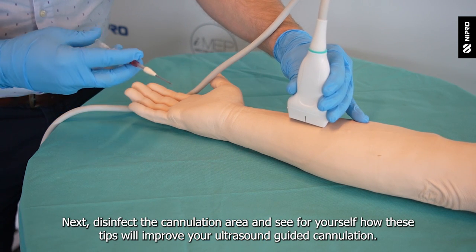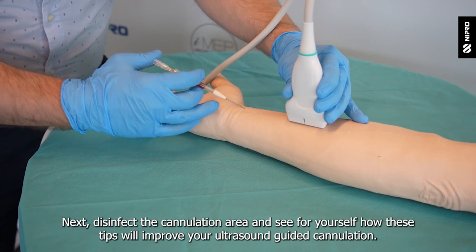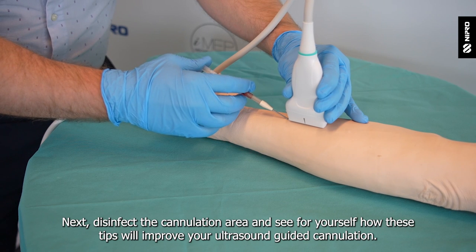Next, disinfect the cannulation area and see for yourself how these tips will improve your ultrasound guided cannulation.